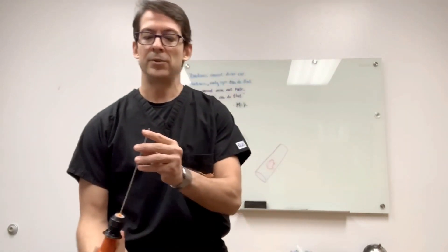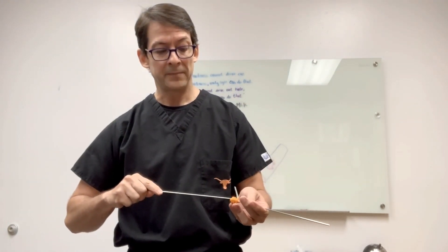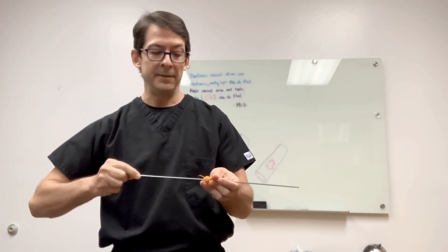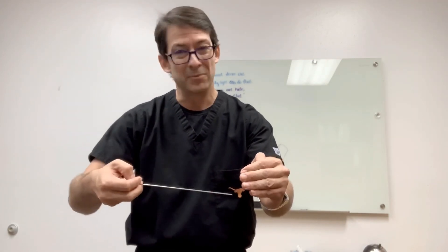A piece of bone should be inside the needle. In the bone marrow system there's an adapter that goes from the tip back to protect the integrity of the bone, but in the biopsy needle you go inside with the pusher — it has a blunted tip. Put the needle on the table, push, and cover with your hand because sometimes there's so much pressure that when you push it, the bone piece flies away — that happens a lot. Most people just cover it with their hand and push to get the sample out, then put it in formalin or saline.